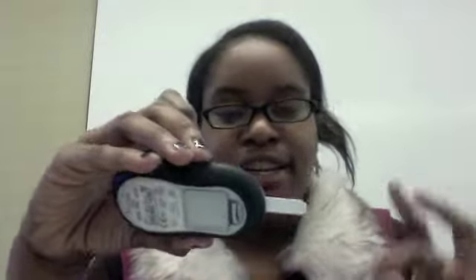So I'm thinking I got enough, just enough. So that's all it needs, just a little bit. And now carefully I'm going to get some blood on my test strip. And now it's calculating. And this is immediate. After you do your testing, definitely make sure that that area is clean again. We don't want blood all over the place.